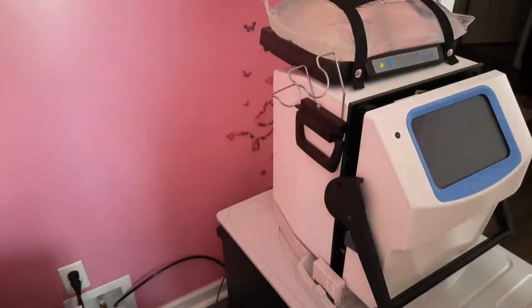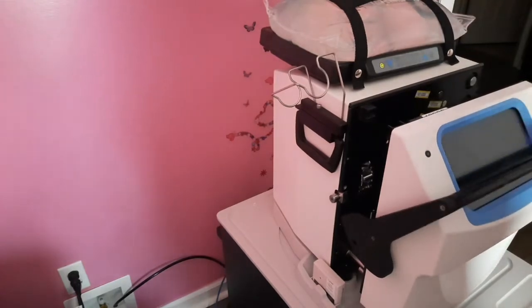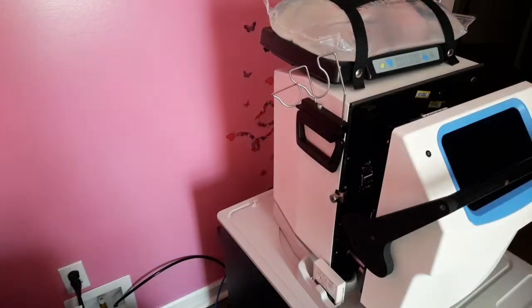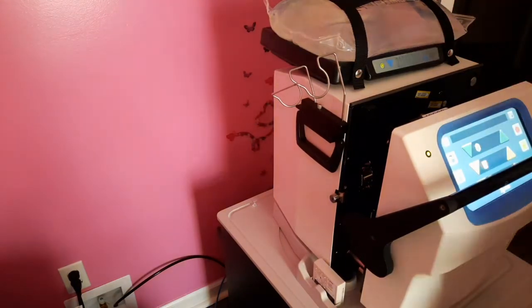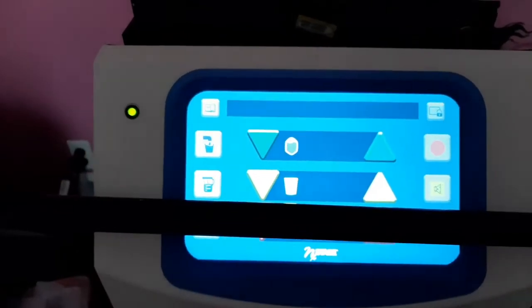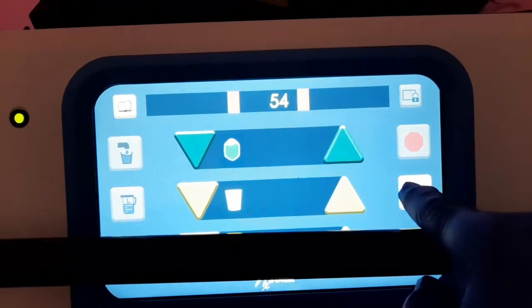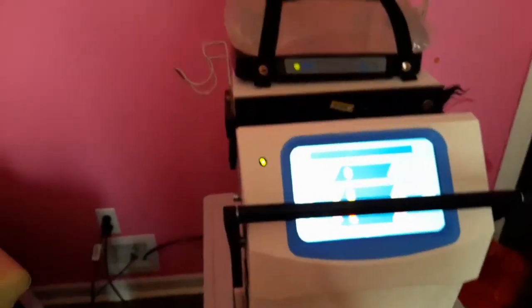Okay, I'm ready. We're going to open the door to the cycler. Then, back over here to the left, behind it, is the switch. So we're going to turn her on. And she is on. And you see all the bells and whistles. She'll come up with eights and then a 54. And there's the 54. And she'll let you know, hey, 54 over here. So you've got to let her know: all right, I hear you, I see you, do your thing. So you hit the mute button over here to silence the alarm, and that's also communicating with the cycler, letting her know she can go ahead and proceed.